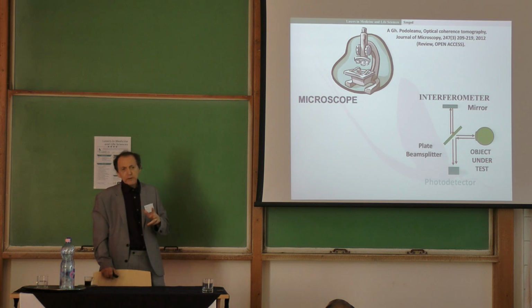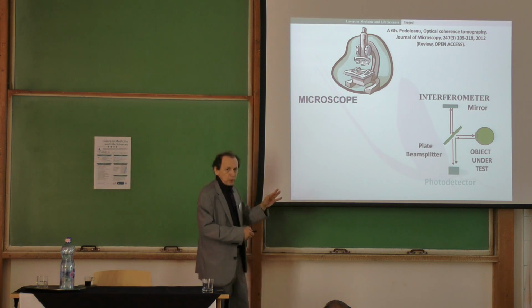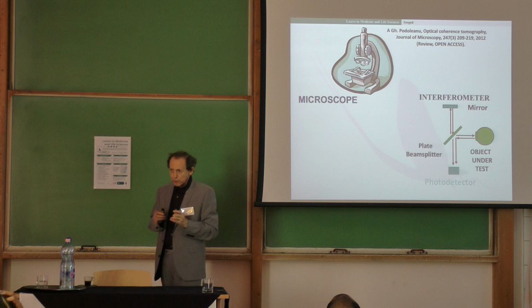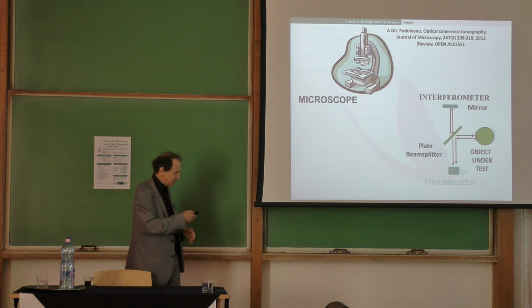The modern OCT, the OCT you are going to see in cardiovascular, is one which uses a tunable laser, basically. So now it's a laser which is tuned and fast. Okay. So let me take you quickly through those 3 types. So again, the Michelson interferometer is there because OCT is interfering, so you have to superpose light coming from the tissue with light from a local reflector. So that is still there.